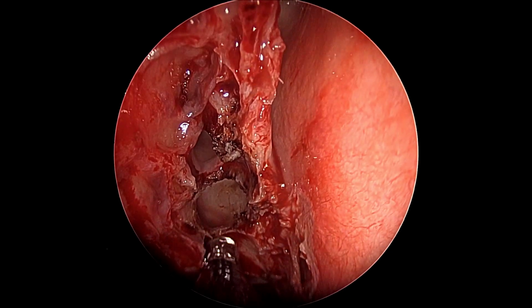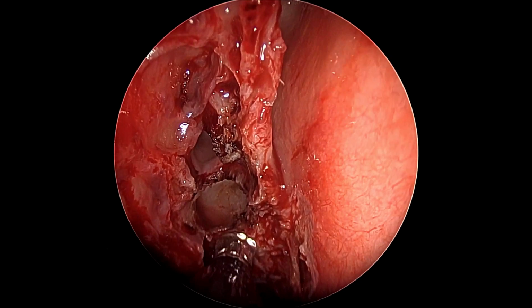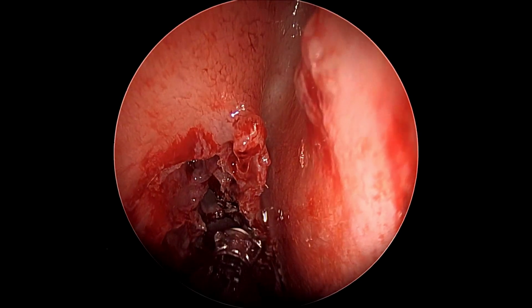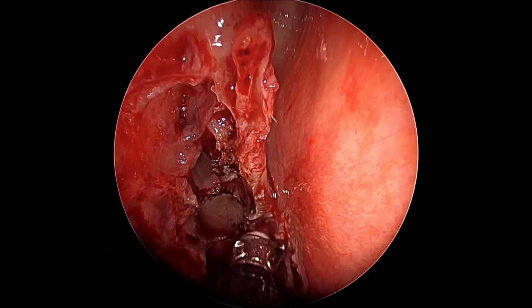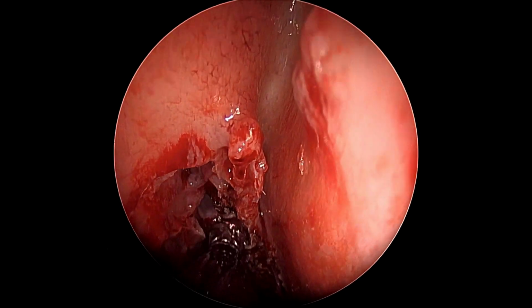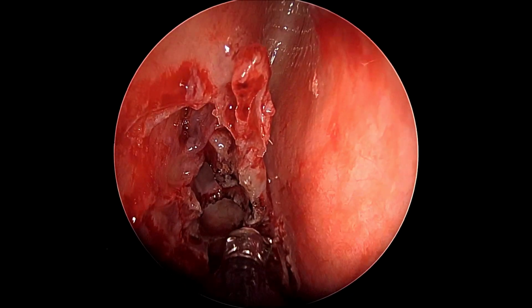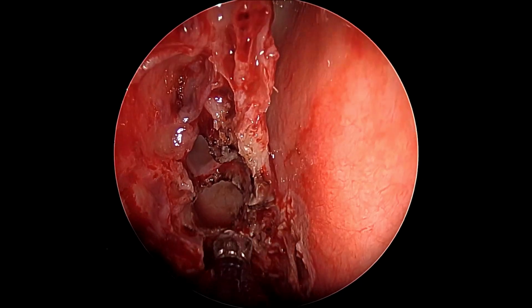Generally, the coagulator is quite safe on the skull base because it doesn't puncture it. We find it safer to use than the microdebrider, which sometimes has the potential to puncture thin bone of the skull base. So using the coagulator without any force, even on the ablative mode, should not lead to any skull base penetration. And that is why during this step, to ablate tissues, we can even use the ablative mode to clean the mucosa around the defect site.